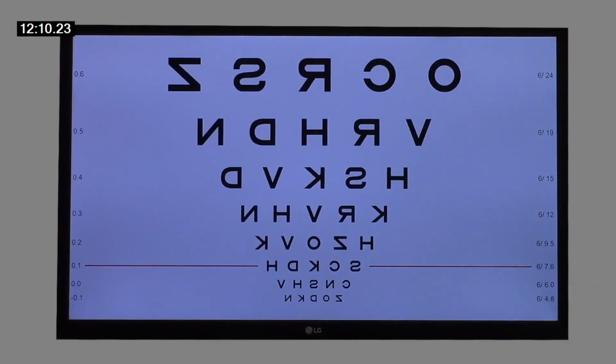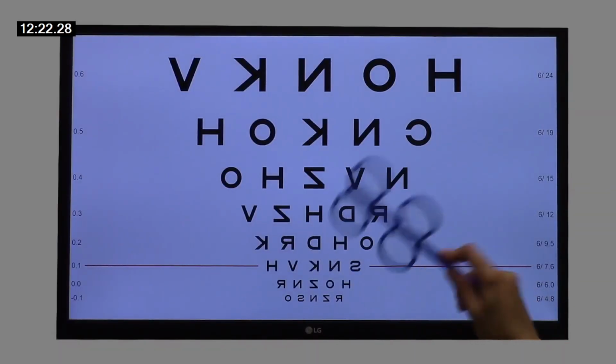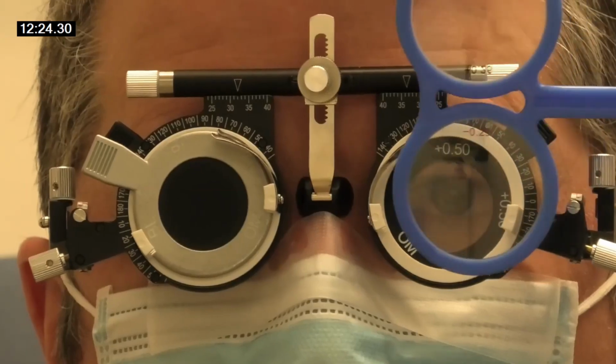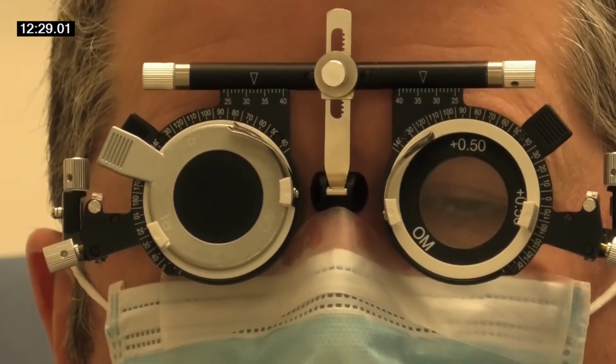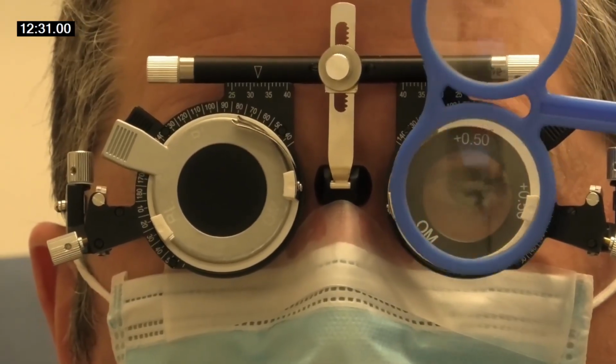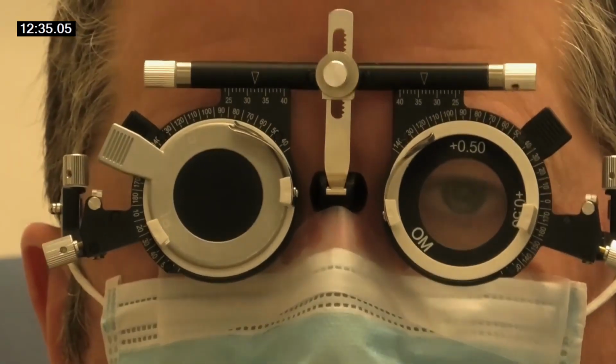Okay, and what's the smallest line that you can see there? The bottom one, so ZODKN. And just looking at the Z over here, is that clearer with this lens, without, or about the same? With, just slightly, yeah. With.